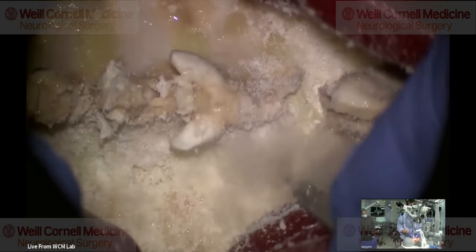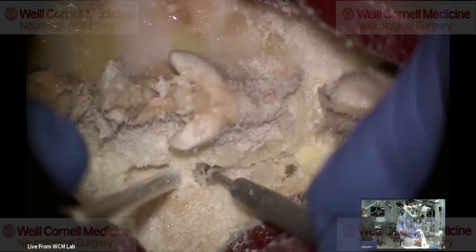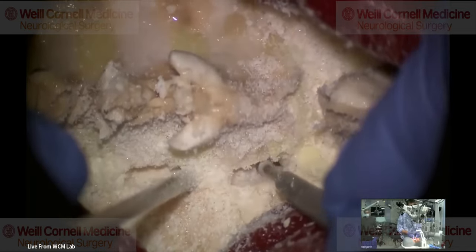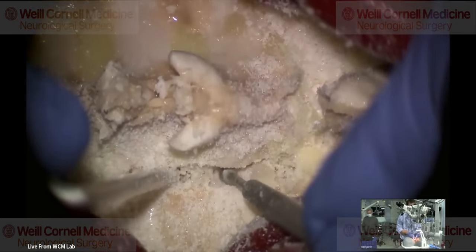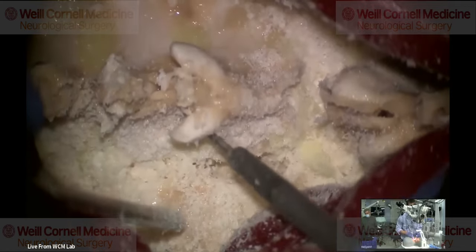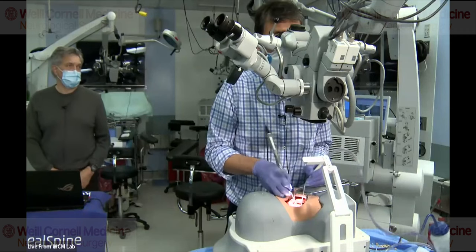And then there are different systems for instrumentation, right? How do you pick which one you use? I think most spine companies have a system you can use, so whichever system you like better. I'm using NuVasive today, but I don't have any conflict with NuVasive for the laminoplasty, although I did recently help them develop a posterior cervical fusion system, but not this. So that one's loose. That one's loose. But I used to use Medtronic. I think other companies have stuff.